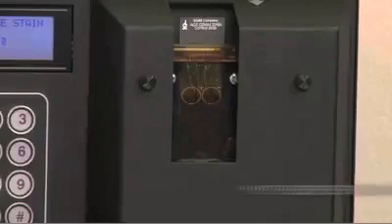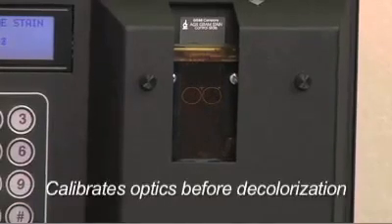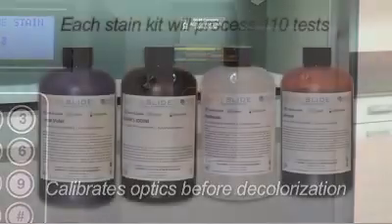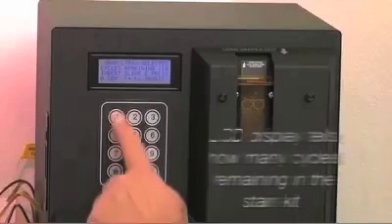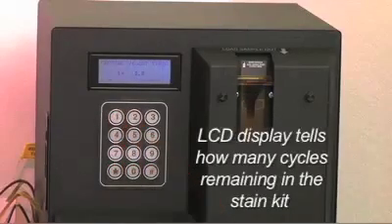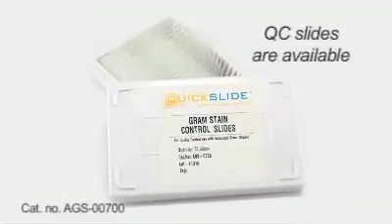The Gram Pro 1 uses fresh reagent for each test, and calibrates optics before decolorization of each sample. Each stain kit will process 110 tests. The LCD display tells you how many cycles are remaining in the stain kit before staining each slide. QC slides are available for this instrument.